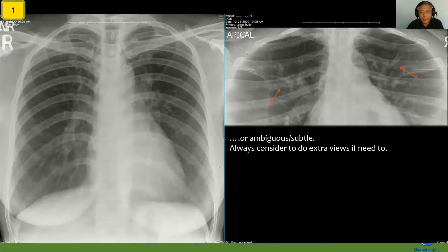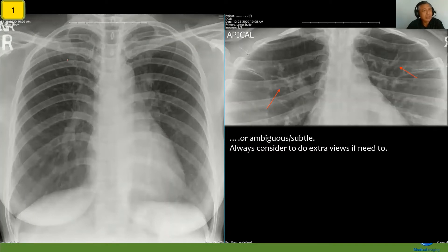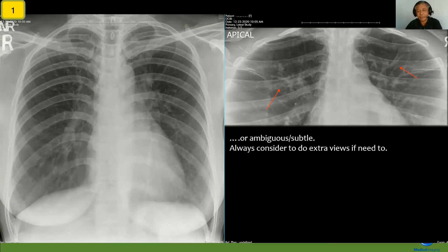But sometimes fibrosis can be ambiguous or subtle, and that's when you really need an extra view to be confident in your diagnosis. Looking at this PA view, in the right upper zone there are what looks like coarse shadows, and comparing to the left it's just not as busy — but you can't be certain. So you'd want an extra view. Considering these are in the apex, it would be an apical view. When you do the apical view, you can now clearly see these extra shadows in the right upper zone, confirming right apical fibrosis.